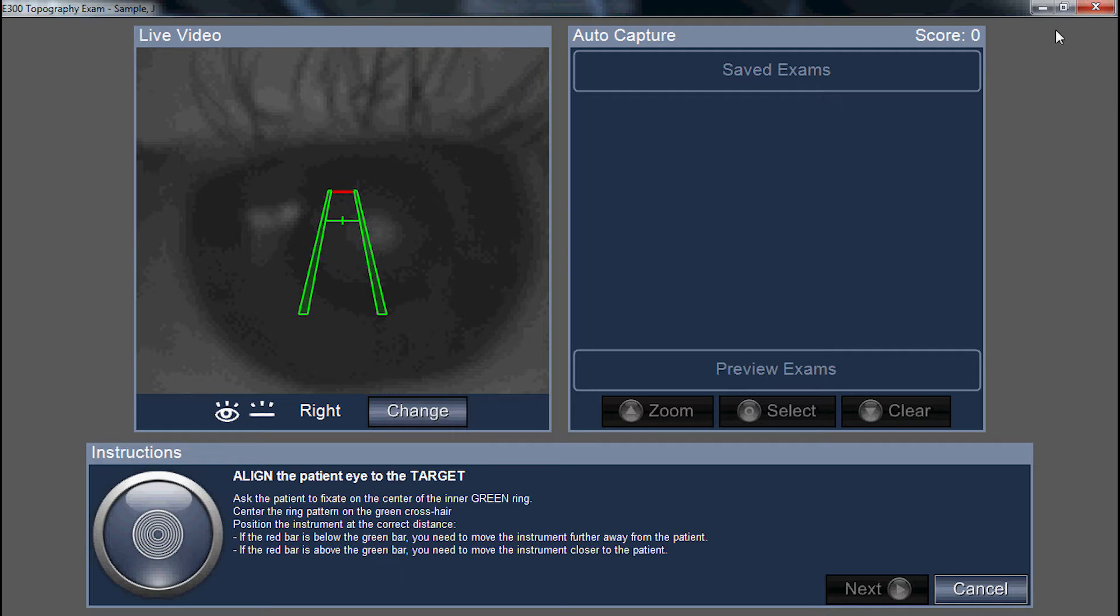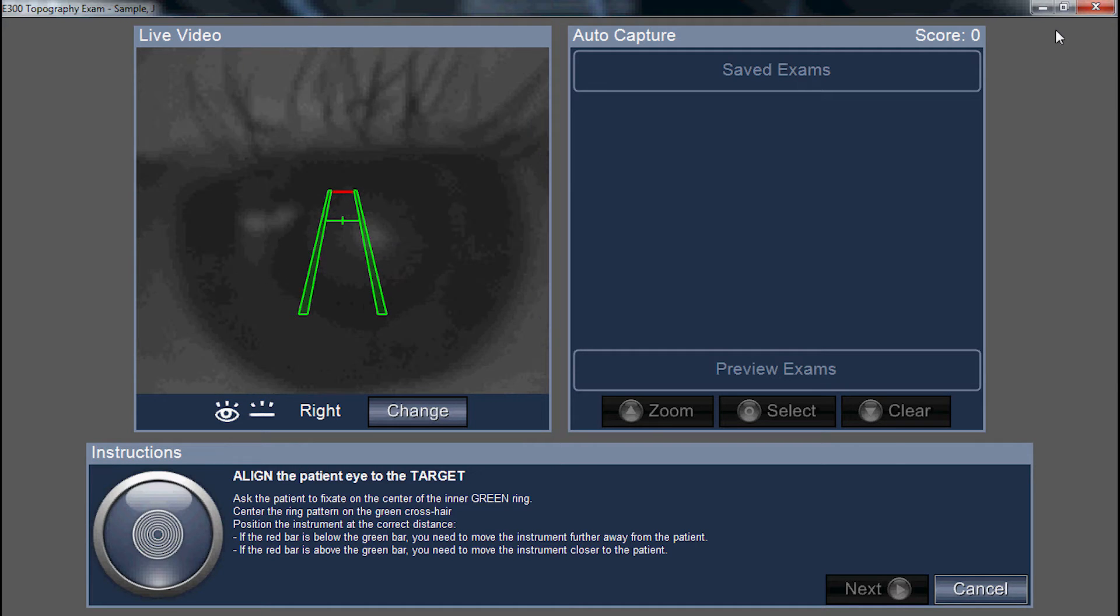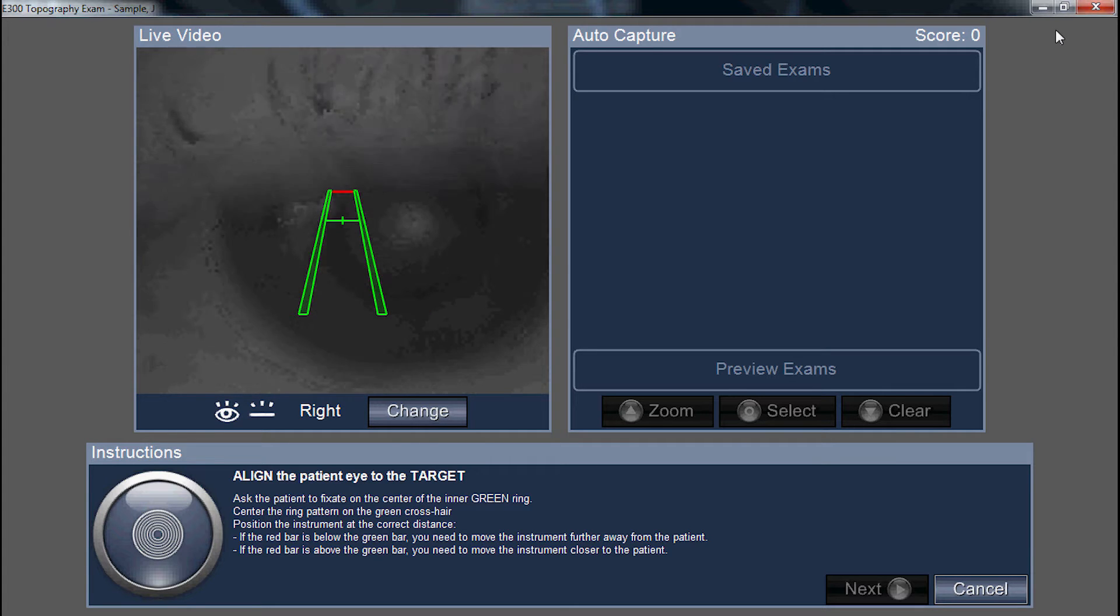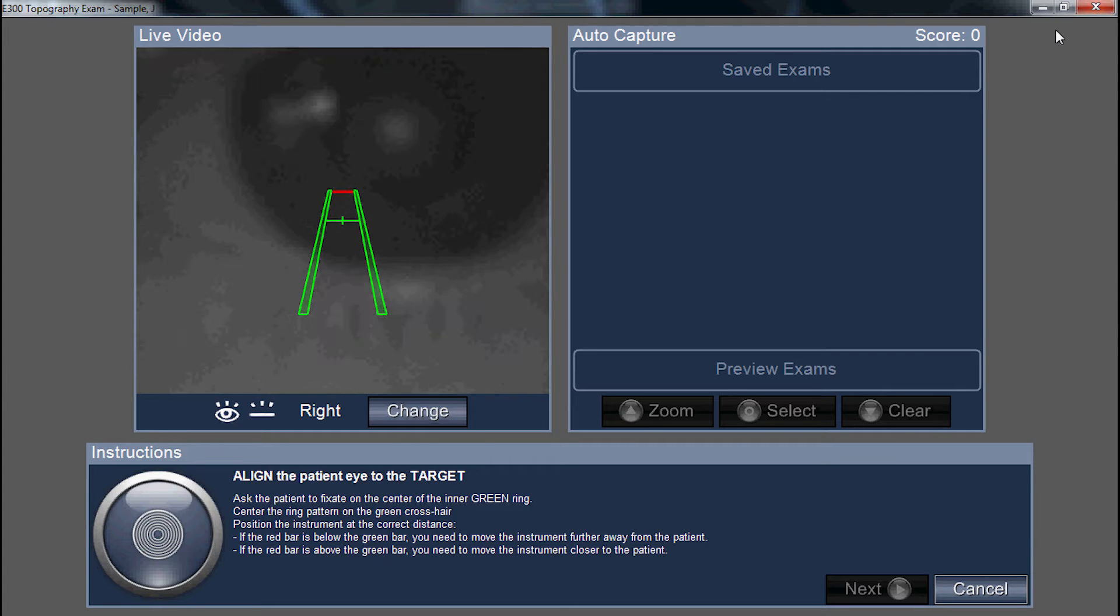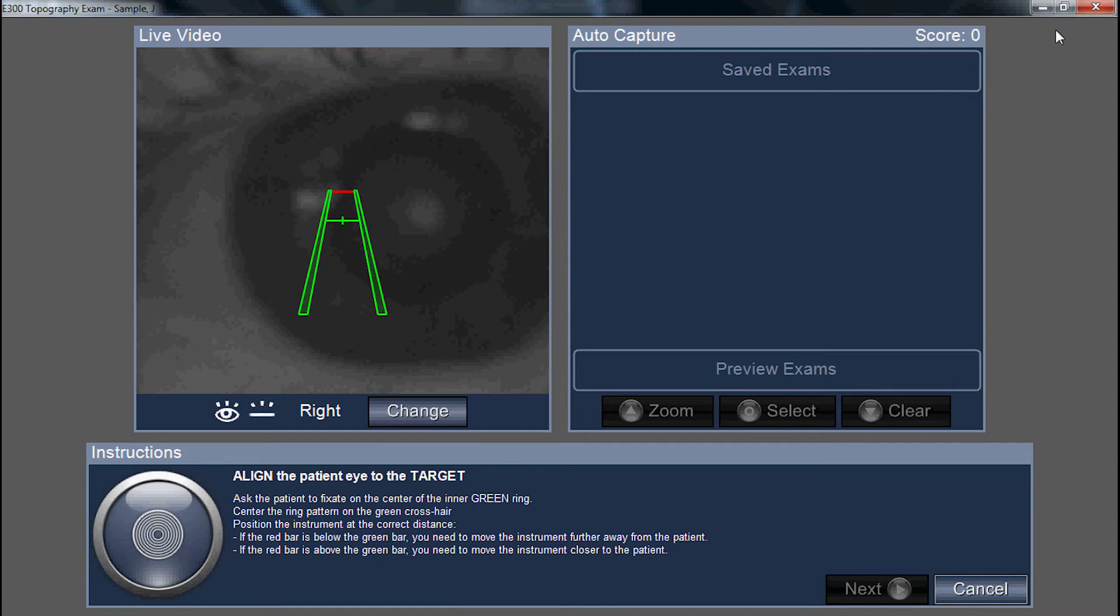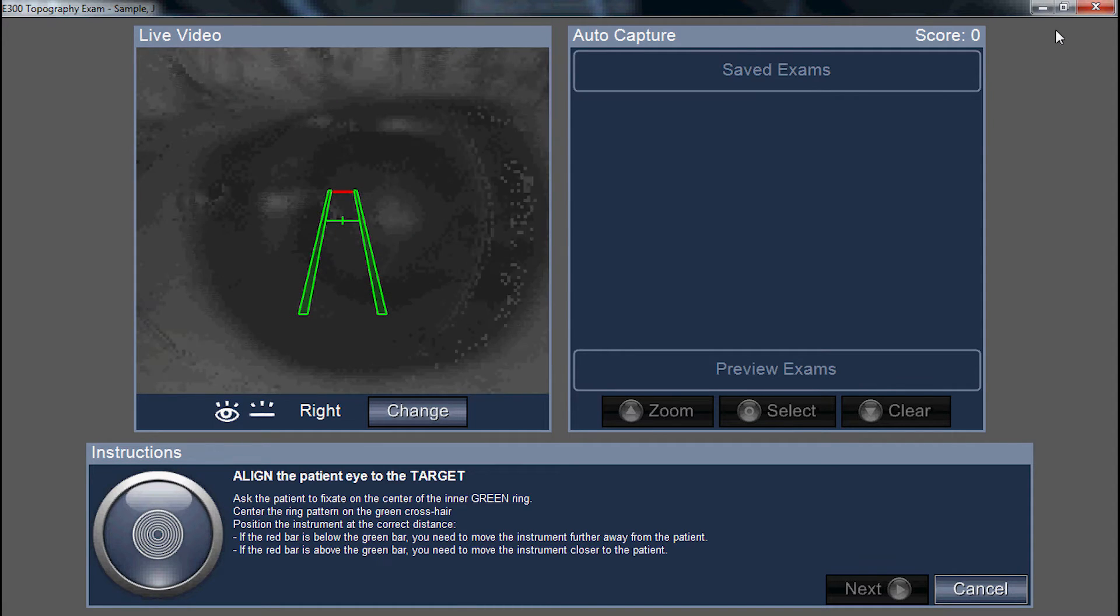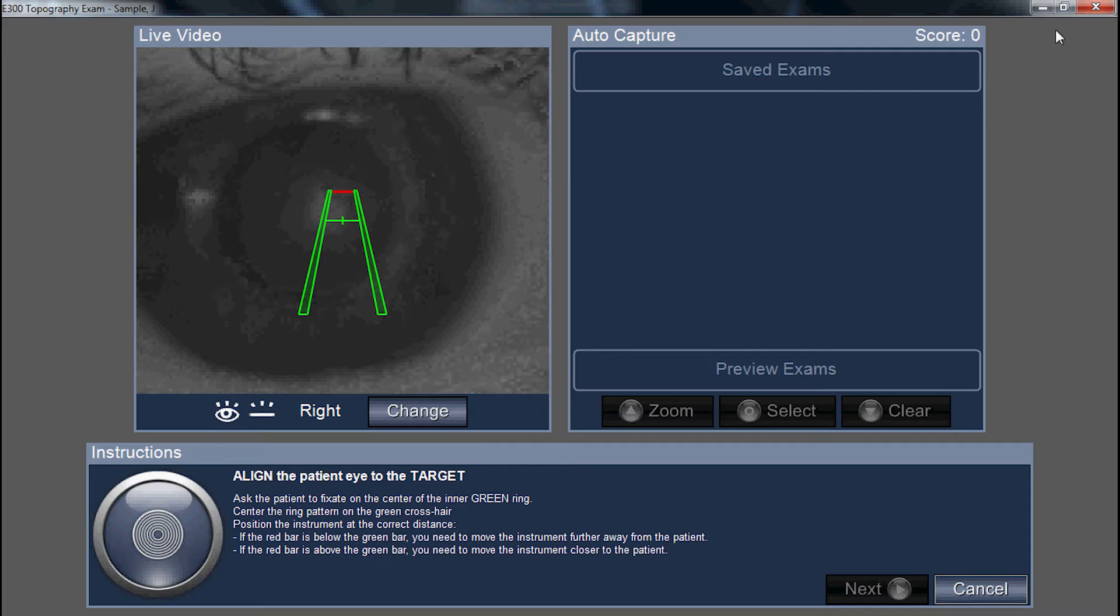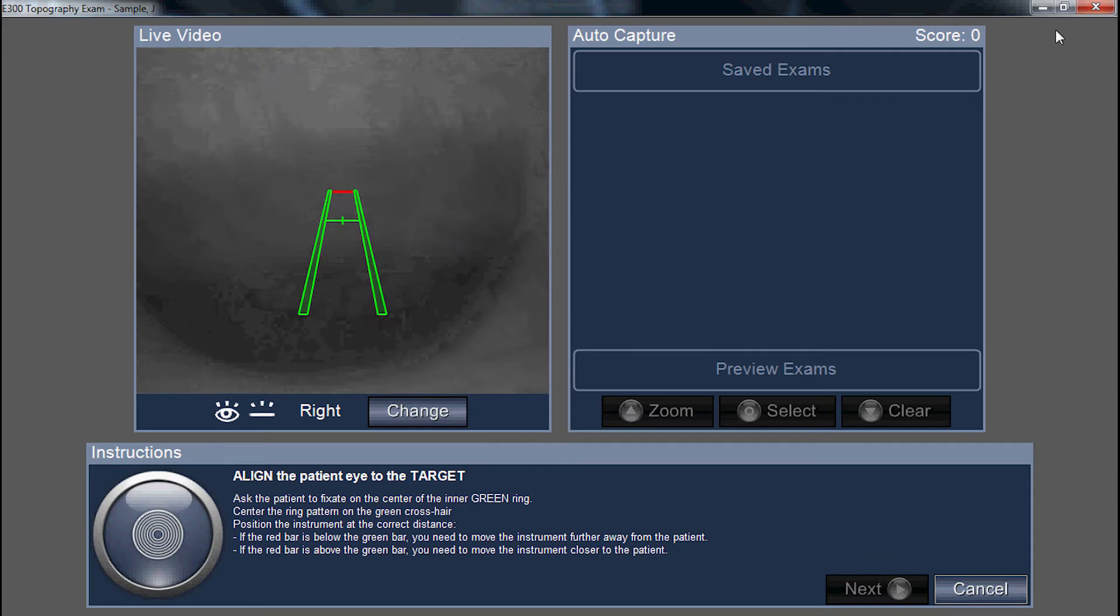When you're ready to take your capture, have the patient move their nose slightly away from the cone to avoid pushing the cone into the bridge or the brow. Take the joystick and center the instrument to the apex ring.